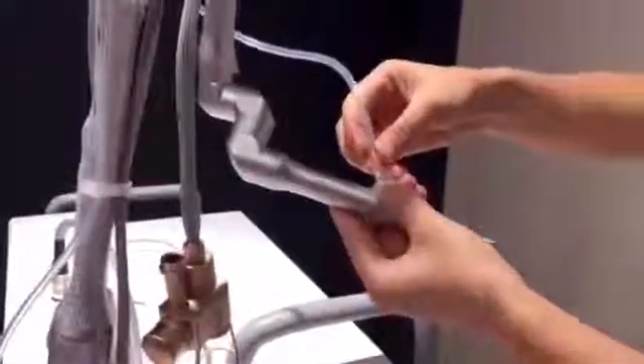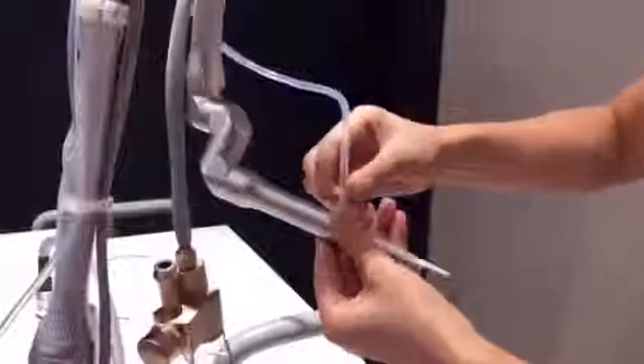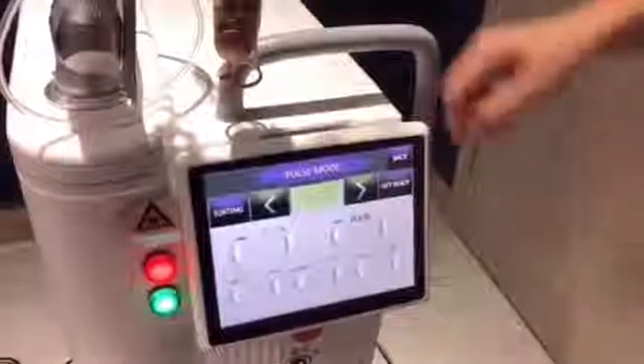Connect the probe in the back. Now you can start the treatment of cutting. Get ready — press the foot pedal to start treatment.